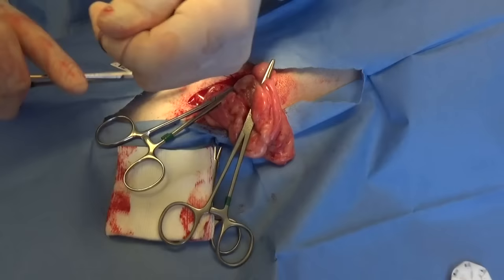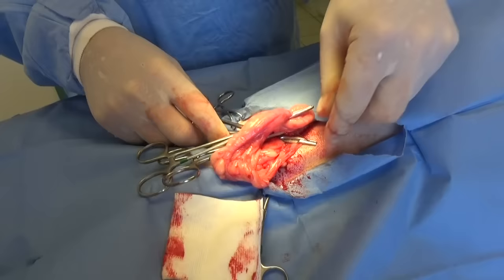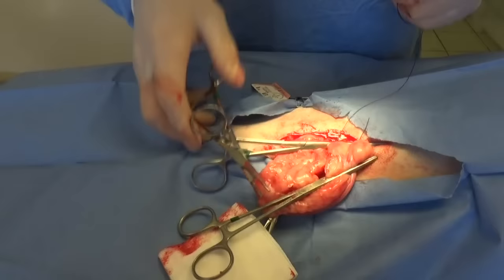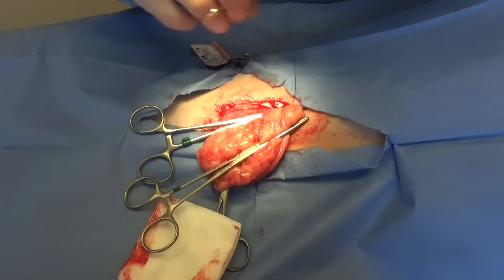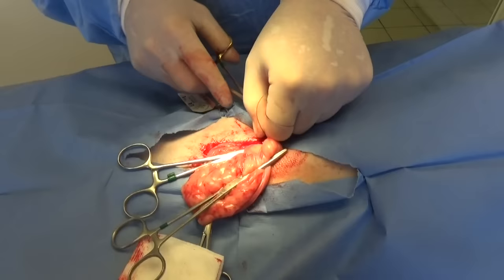And you're thinking, wow, isn't there a lot of bleeding there? No, that's oozing. That's okay. So far, so good. So I'm going to bring the suture around this side now, because we're going to tie it off that side, and we put it right through. It's called transfixing. And I'm going to go ahead and do the knot, the three throws on my instrument. And that way, if you transfix it, it won't slip. If you put the needle through that area, it won't slip. And we don't want it to slip. So there's four throws there. We call them throws. There's four square knots.